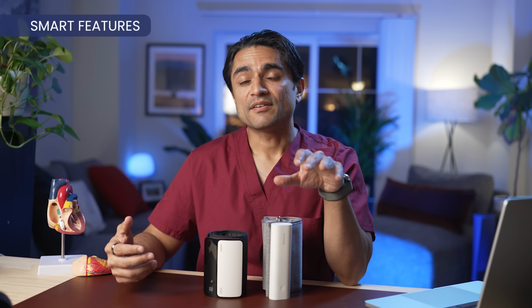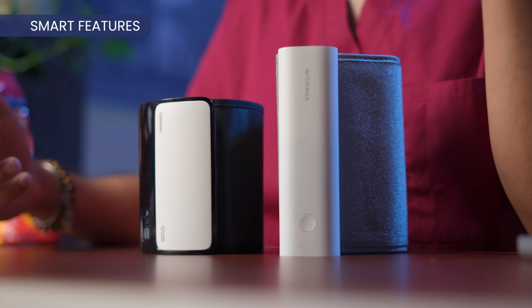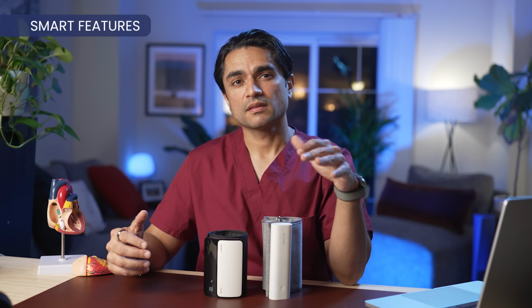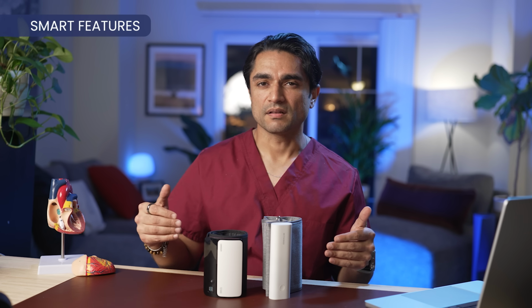I definitely found a difference between the Withings and Omron apps when connecting to Apple Health. Withings made it easy, but Omron was inconsistent. The Withings app has true integration with Apple Health. The readings from their app synced completely to Apple Health. I did have issues with the Omron app though, because it didn't sync the readings from Omron's own app to Apple Health, at least not every time.